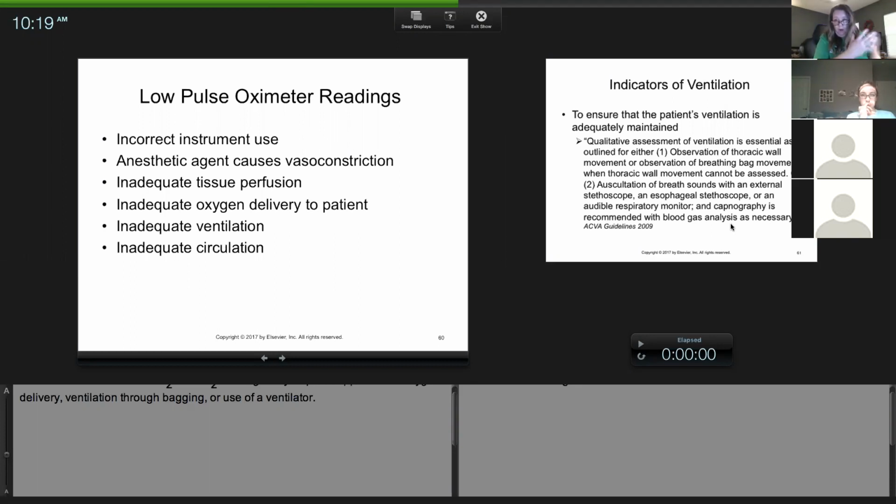I thought the air was not moving in the anesthetic machine. But the way I discovered it is I disconnected the animal from the machine, because if the machine was locked up, I had to get the dog off that machine. But when I disconnected him, he was still blue and gasping for air. I thought, his tube is clogged, he can't breathe. And right there, it told me it wasn't a machine issue and it wasn't an oxygen tank issue. So now I have a patient.